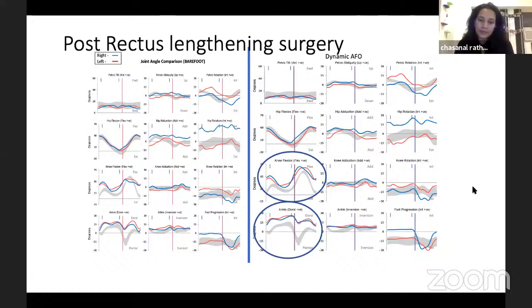So actually, here we did a gait analysis with an orthosis for him, sir, and the orthosis was actually improving this. And the next part was that actually I could use this same example, but I didn't use it.